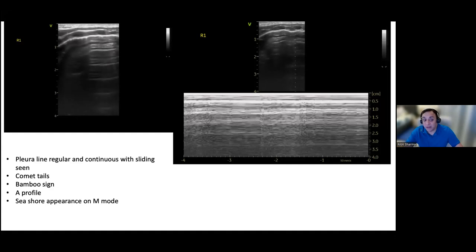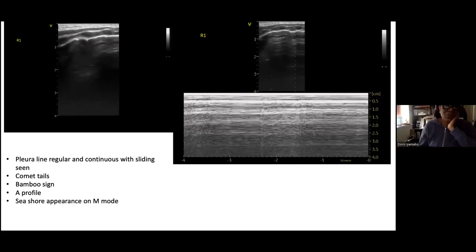But sometimes the challenge is that when you download, it saves at a much lower frame rate. That's something I've struggled with on some of our machines. So you might still do that, but get the image that you've currently stored. When you were looking at the image, was it faster than this? I don't remember, actually. I don't know.